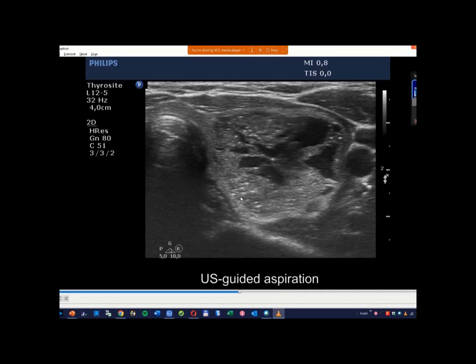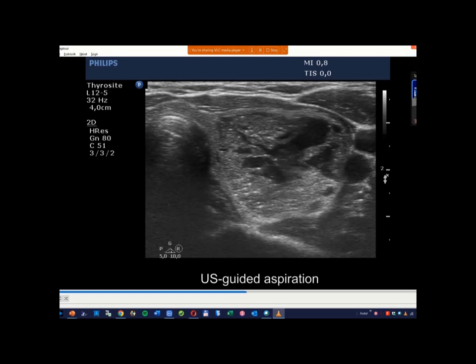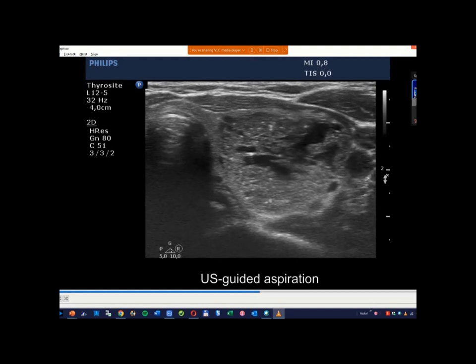So if we have other explanations, see this line, maybe line or granule, I don't know, here is a line, there is a line, so equally bright lines can be found. And most of these figures are partly related. So see that one. Here is clearly a very tiny anechoic spot ventral to this echogenic granule. Here is a quite a bit larger anechoic spot. So it is not a simple case to answer.